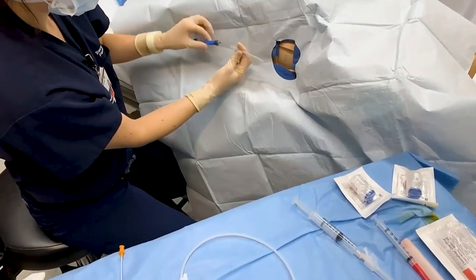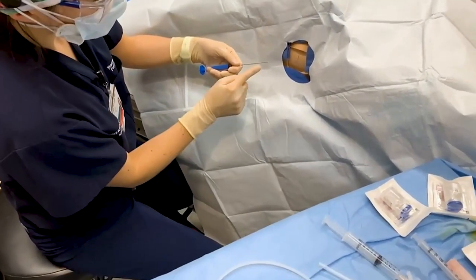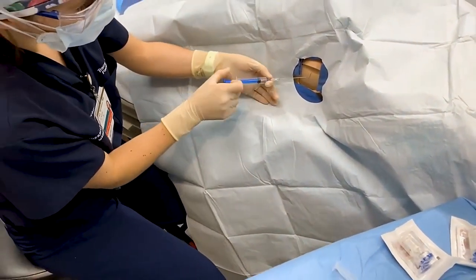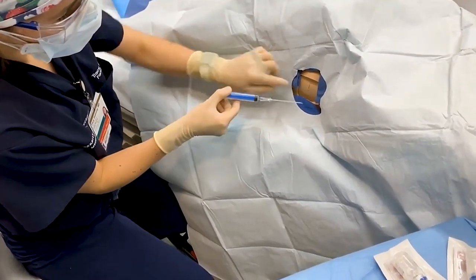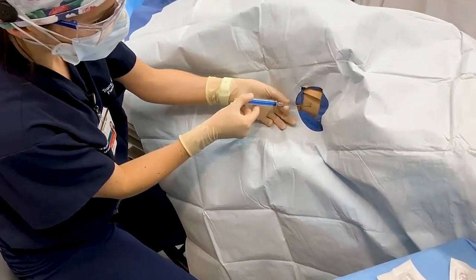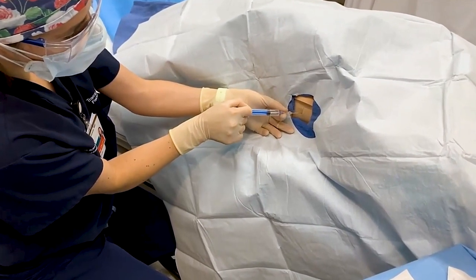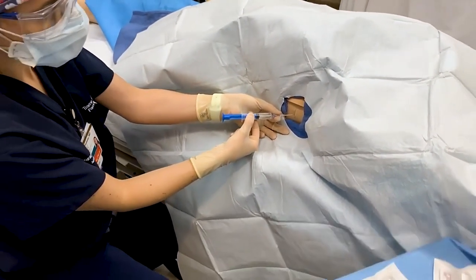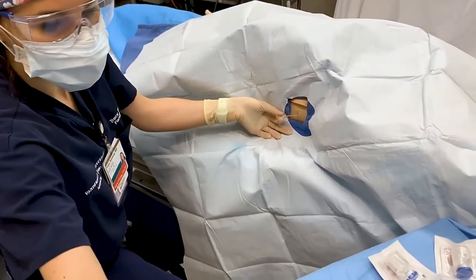Once the lidocaine is in, you then have your finder needle. This technique is basically the same as a central line Seldinger technique. Utilizing the finder needle, you're going to go over the rib, just the same as the chest tube, and aspirate as you get into the chest cavity. You will either feel a rush of air, or if you have some lidocaine still in your syringe, you'll see bubbles come up into the lidocaine.